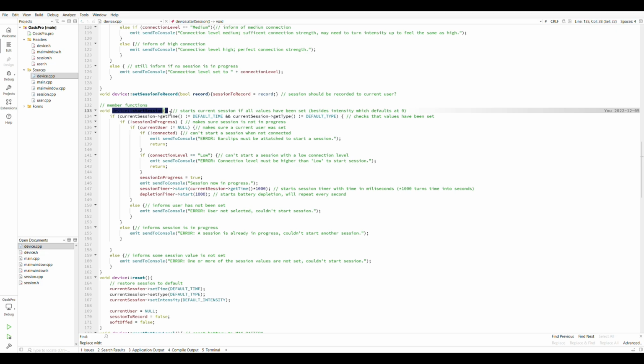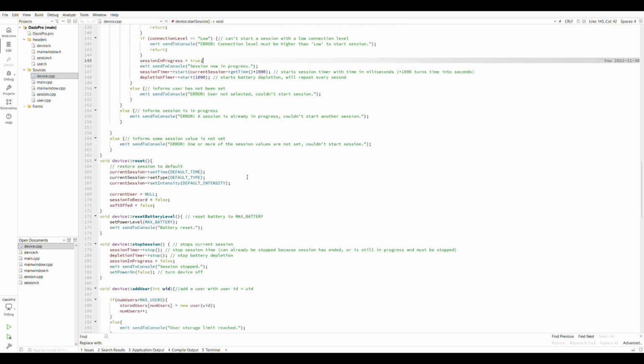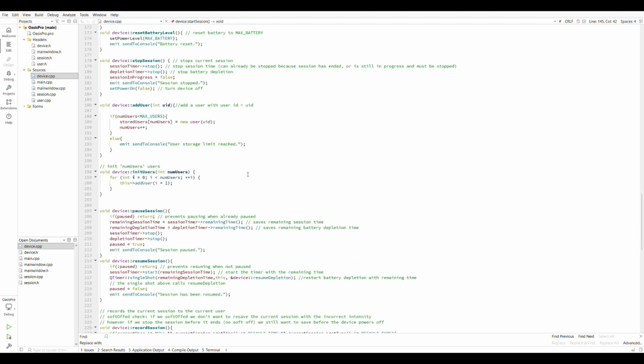So when you hit start, what happens? It basically does a bunch of checks based off of a bunch of flags here to determine which state you're in. And then it'll emit when a session started, and it'll start the timers and the depletion timer, so the battery starts to deplete and everything. So yeah, that's just a little surface level of it.